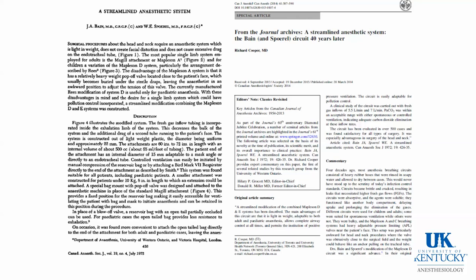And as you probably are aware, the Bain circuit was invented by two Canadians. I do encourage you to read the original paper. It's only 10 pages in length with photos, and this special article from 2014. There's no doubt that we do not ventilate patients the same in 2015 as we did in 1972. The development of lightweight plastic circle systems may have well supplanted the benefit of the Bain circuit.